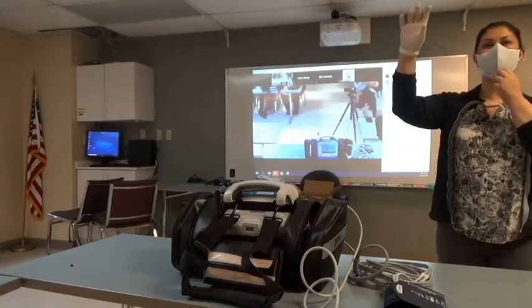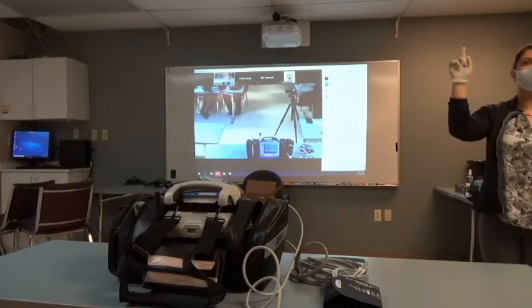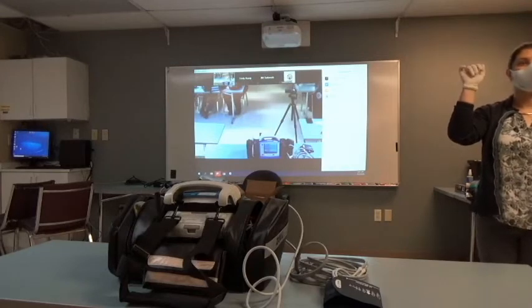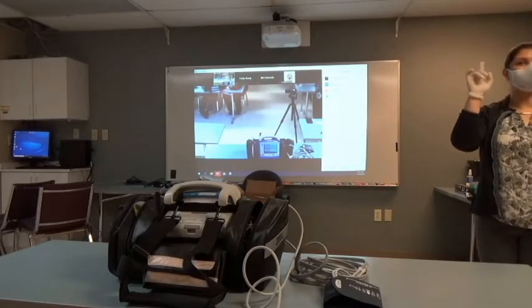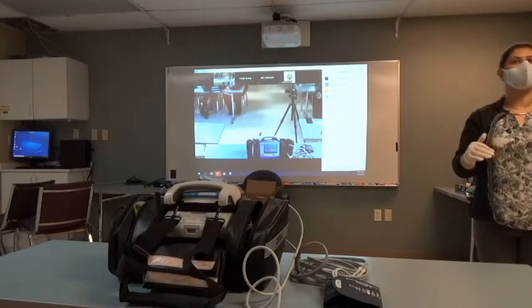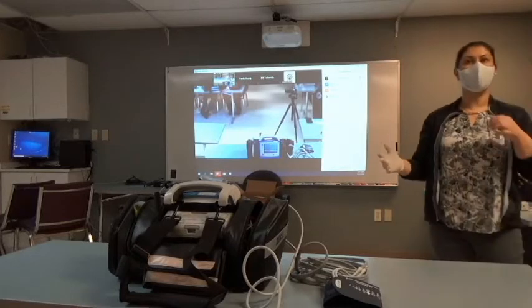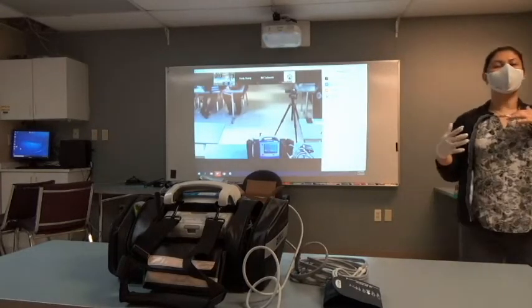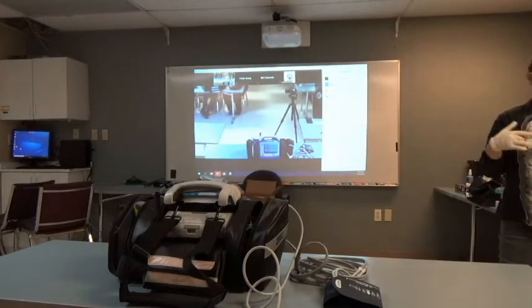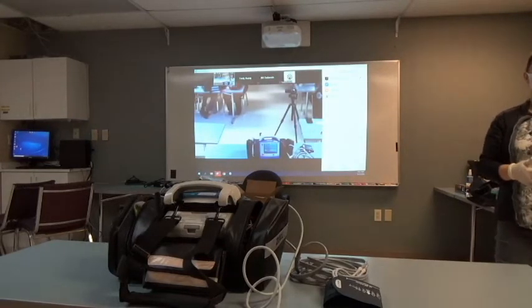Let me get your attention for just a moment, because I think some people weren't sure how to get into AED mode. To get into AED mode, you hit the analyze button. That's going to put you into AED mode. From there, you just follow the directions. In adult mode, it's going to tell you to perform CPR. It might tell you to deliver a shock and so forth.